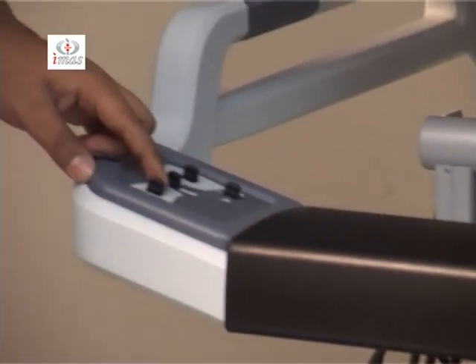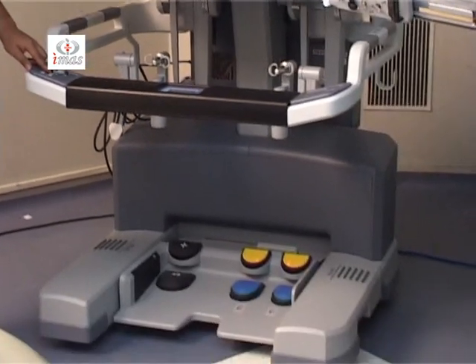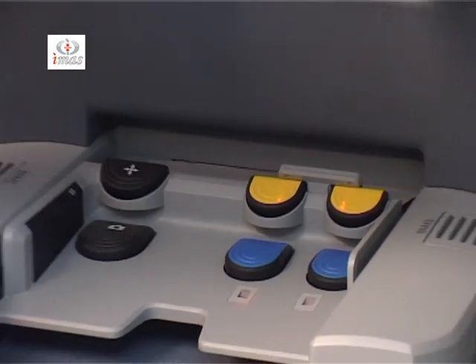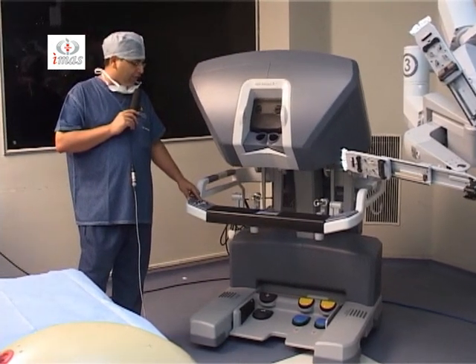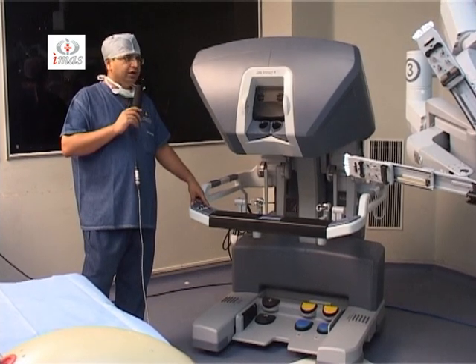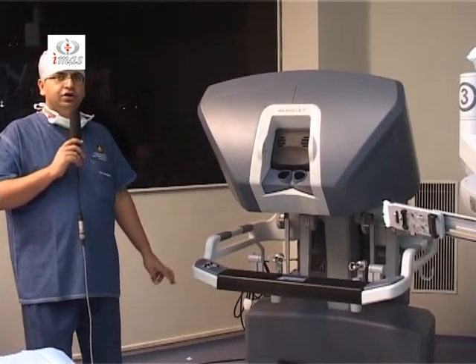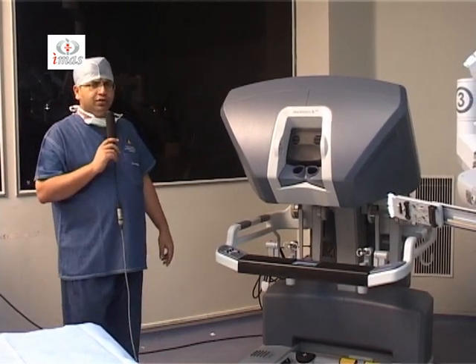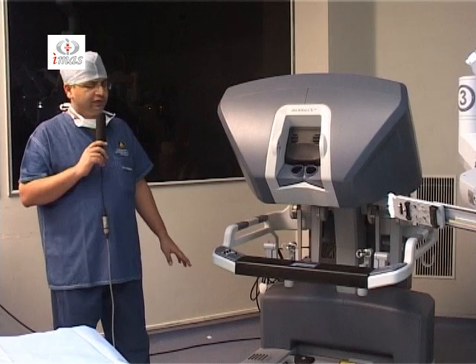These are the ergonomic controls. There are four types of controls. This one is for foot pedal in and foot pedal out. This one is for adjusting the height of the armrest. This is armrest down and this is armrest up. And this one is for height of the shell, master console shell. This is moving up and down, and this is for the tilt of the shell. So all these movements can be adjusted according to the surgeon's height, and therefore the surgeon can sit ergonomically comfortable on the console while performing long surgeries without aching his spine or his neck.